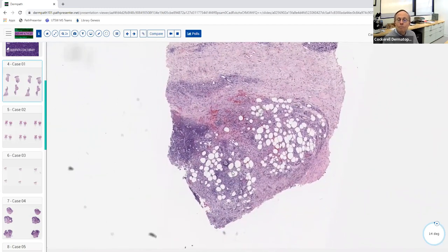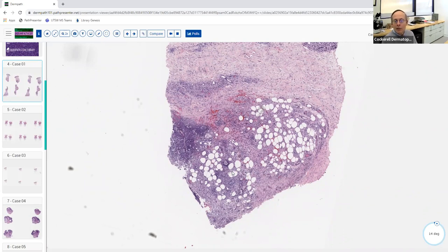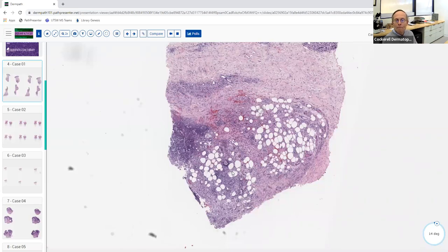Well, I suppose you could look for the specific cells comprising the infiltrate and see what they're comprised of. That is one of the next steps. The other thing we often do is look to see if there's any vasculitis. If you get a lobular panniculitis with vasculitis, that puts it into a very small category of entities like nodular vasculitis, erythema induratum, migratory thrombophlebitis. Then you look to see how much of the septa of the lobules are damaged. In nodular vasculitis you'll see the larger vessel with suppuration and granulomatous inflammation. Subcutaneous polyarteritis nodosa or migratory thrombophlebitis can actually be septal panniculitis because they may be in the septa with not much lobular inflammation. So look for vasculitis next.